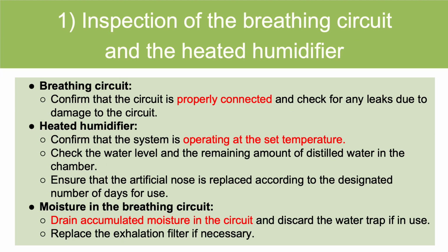When inspecting the breathing circuit, check each connection for looseness, damage or leakage. For the heated humidifier, confirm that it is operating according to the preset temperature and that there is an adequate amount of distilled water. In the case of using an artificial nose, replace it according to the designated number of days. Also, visually check for the amount of condensate water in the circuit and remove the water if necessary.